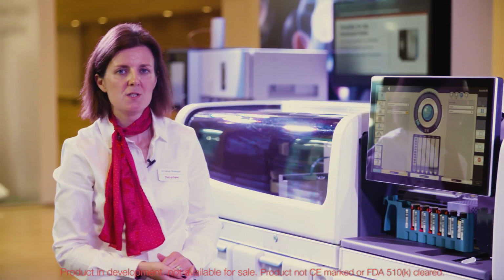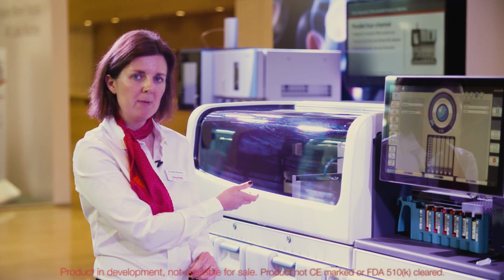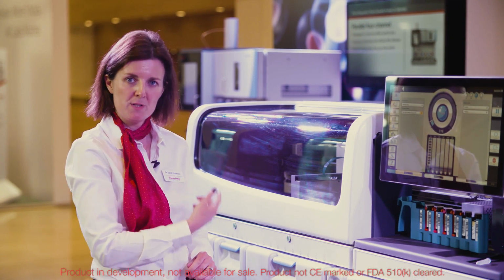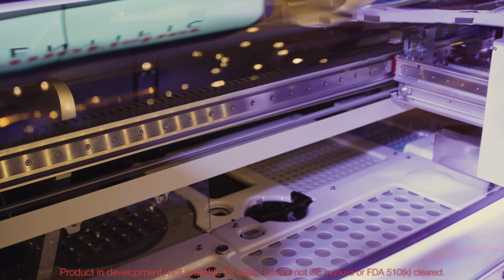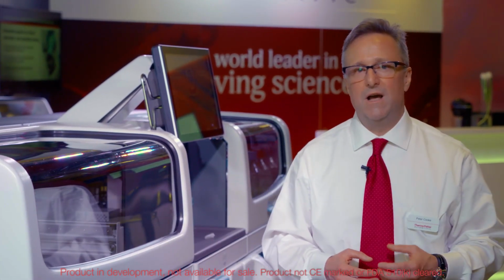So after the reagents have been added, the extraction vessel will be moved to the mixing plate, mixed, before moving into the centrifuge where it will be spun down and made into a pellet. We'll then inject the sample onto the LC-MS system. And also there's a secondary sample cleanup phase to remove non-target molecules based on proprietary TurboFlow technology.